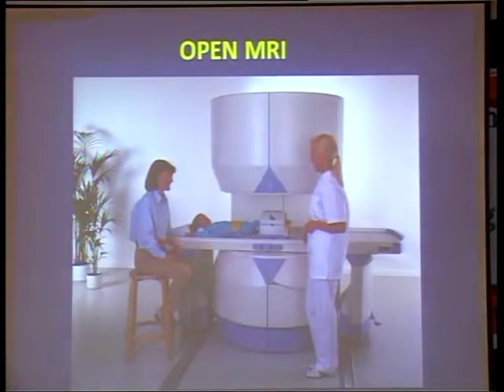Next one. Now open MRI is also being used. Open MRI is useful, but the magnetic strength cannot be much. They are trying to increase the strength, but how successful they will be is left to the company people, isn't it? Next one.